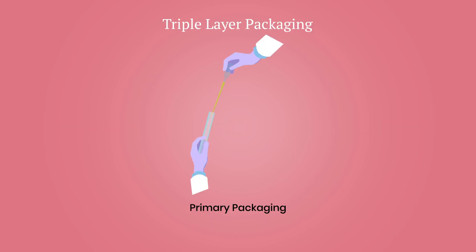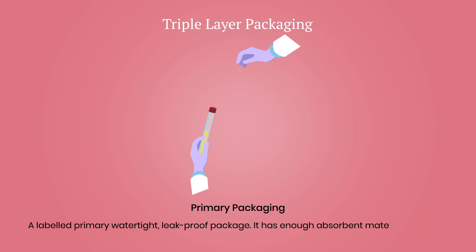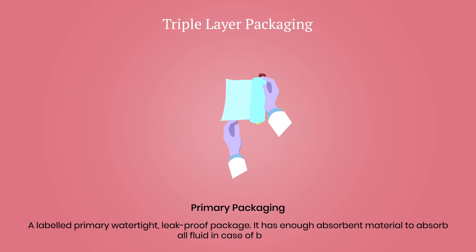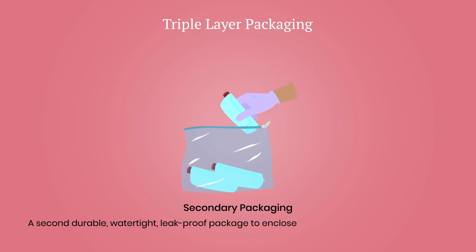First layer package: a labelled primary watertight, leak-proof package containing the specimen — that is, an externally threaded screw-cap cryovial. The package is wrapped in enough absorbent material to absorb all fluid in case of breakage. Second layer package: a second durable, watertight, leak-proof package — that is, a zipper pouch — to enclose and protect the primary package.